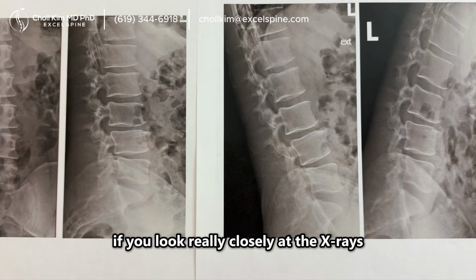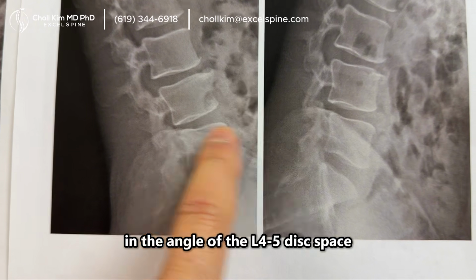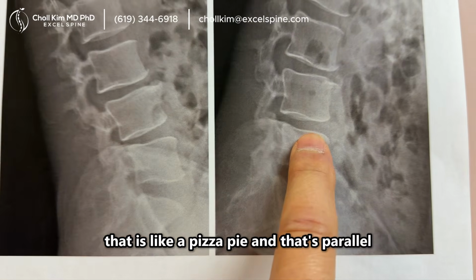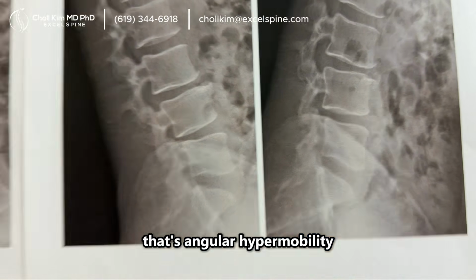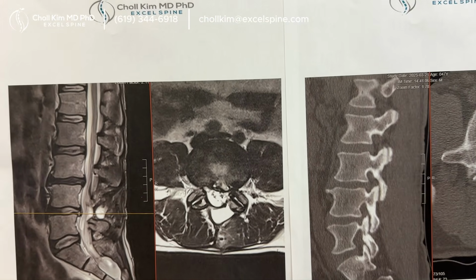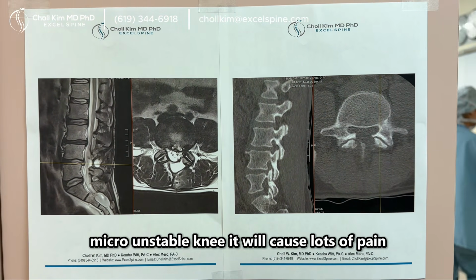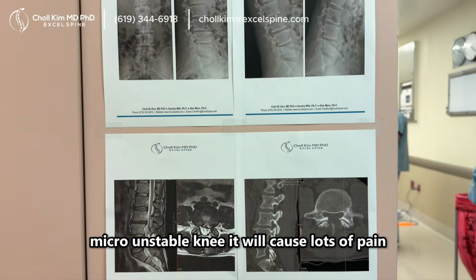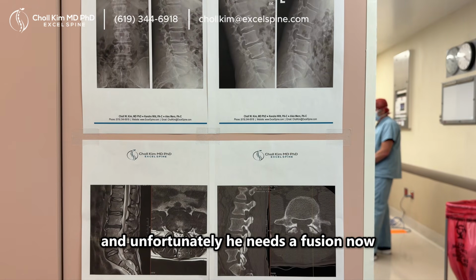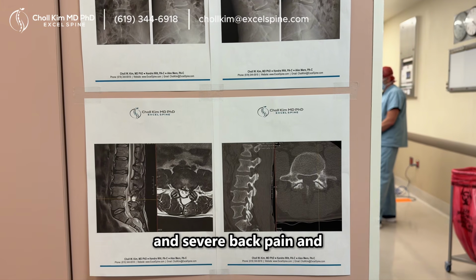If you look really closely at the x-rays, if you look at the difference in the angle of the L4-5 disc space when you bend forward versus bending back, that is like a pizza pie, and that's parallel. That's angular hypermobility in the setting of a patient that has had 2 laminectomies. And it's like an arthritic, micro unstable knee. It will cause lots of pain, and unfortunately he needs a fusion now, but I think that's going to be a great operation for him because he does have angular instability and severe back pain.